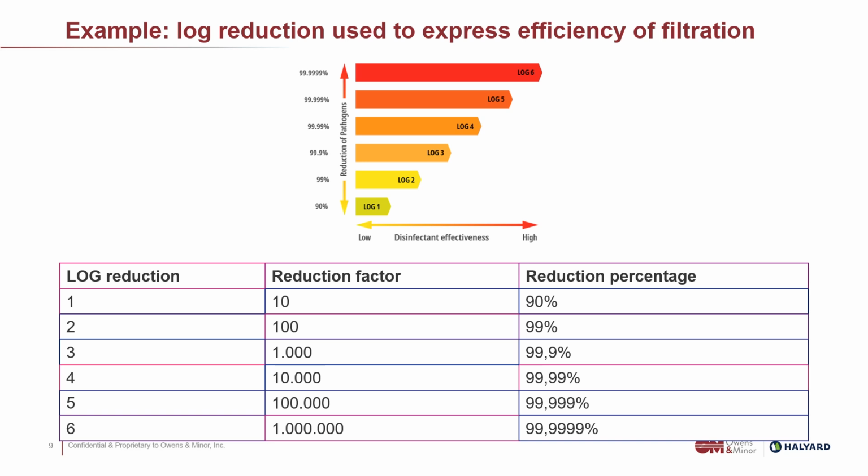A log reduction 1 is only a tenfold that you reduced. So we go here from 90% to 99.9999%, which is a much bigger reduction. As an example, we have here a disinfectant. The first disinfectant only has a log 1 reduction. 10% of the bacteria will survive. Whereas once you come to a log 6, there's practically nothing left here.